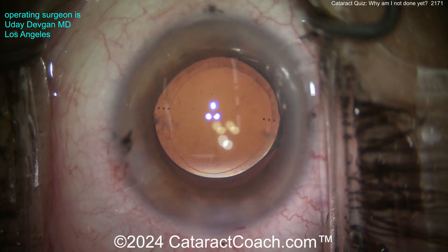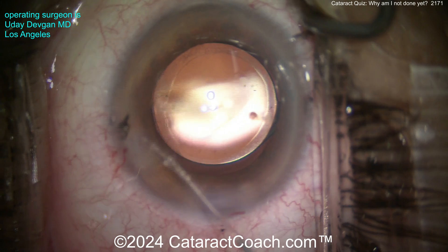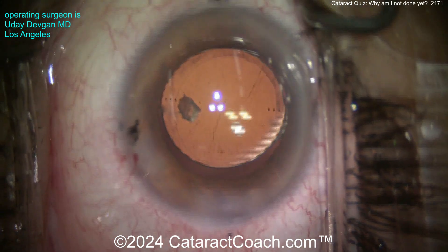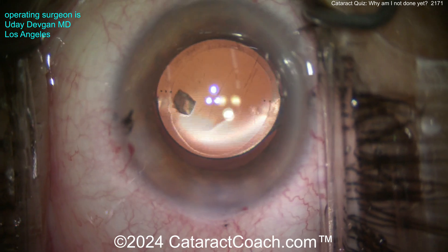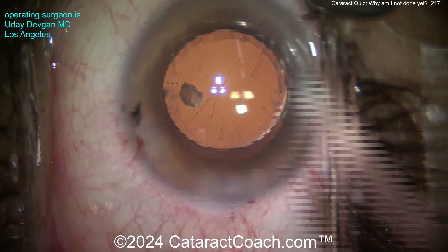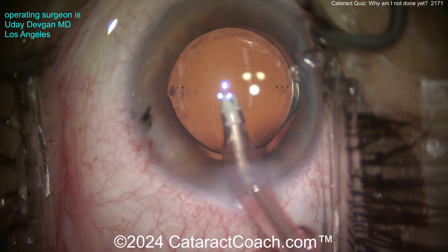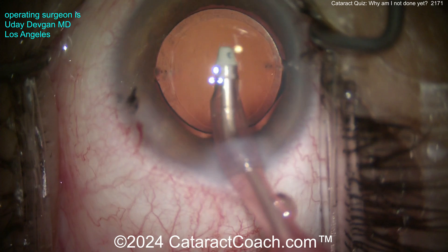Look near the paracentesis on the left side of your screen — there's something going on. You didn't even see it, did you? That's because the view through the video is not as good as through the microscope. So aspirate that piece down — and check this out, I've got another surprise for you.